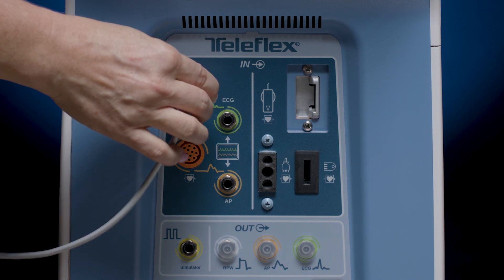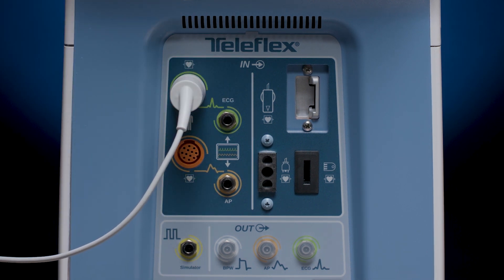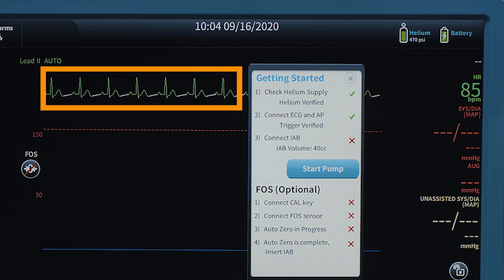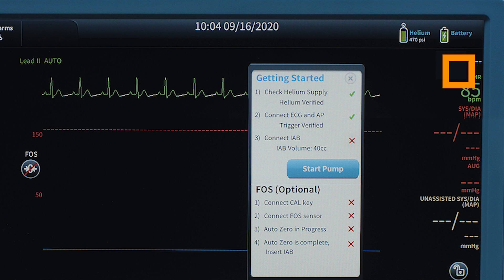Establish direct ECG connection via chest electrodes. For consistent triggering, it is important to verify the ECG signal is adequate. White overlays on the ECG trace and a red heart symbol icon flashing with each heartbeat indicates the presence of a triggering signal.